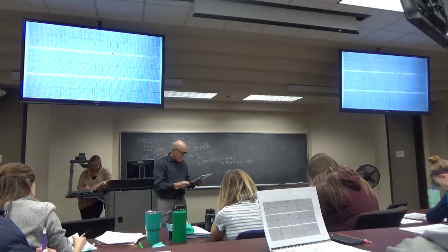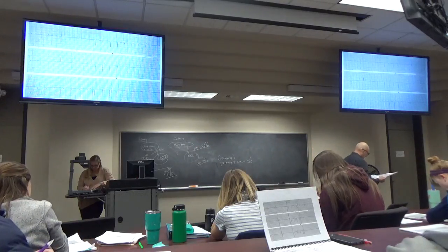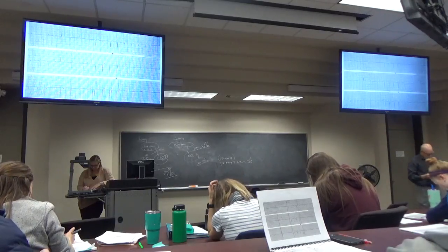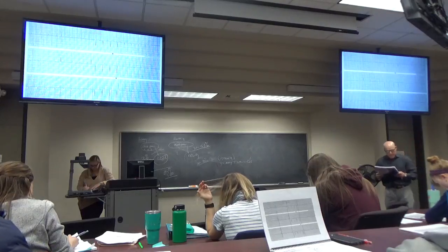PR was noted to be greater than 0.2. So for conclusions, I have written down LAD at minus 65, first-degree AV block, and an infarction at the inferior, septal, anterior, and I determined that to be acute. Acute.